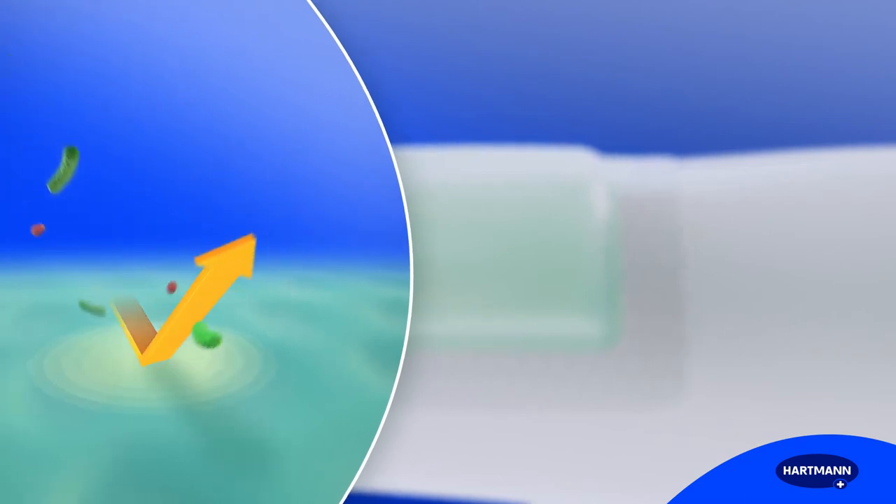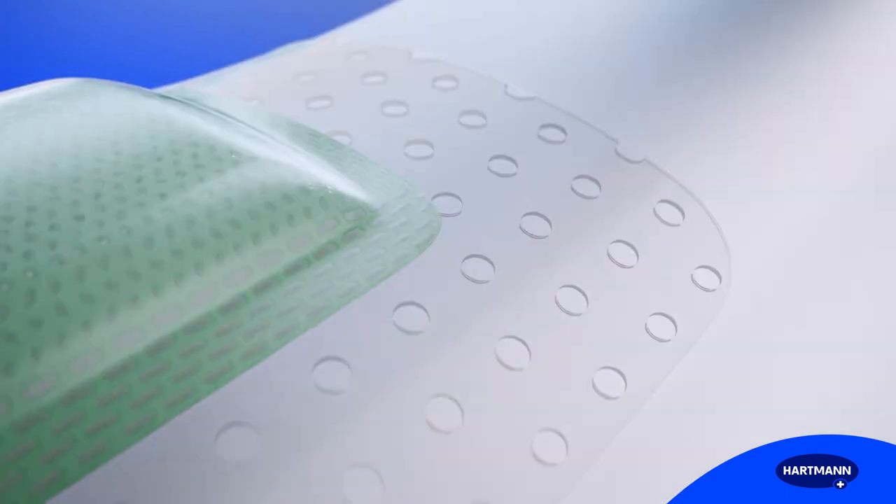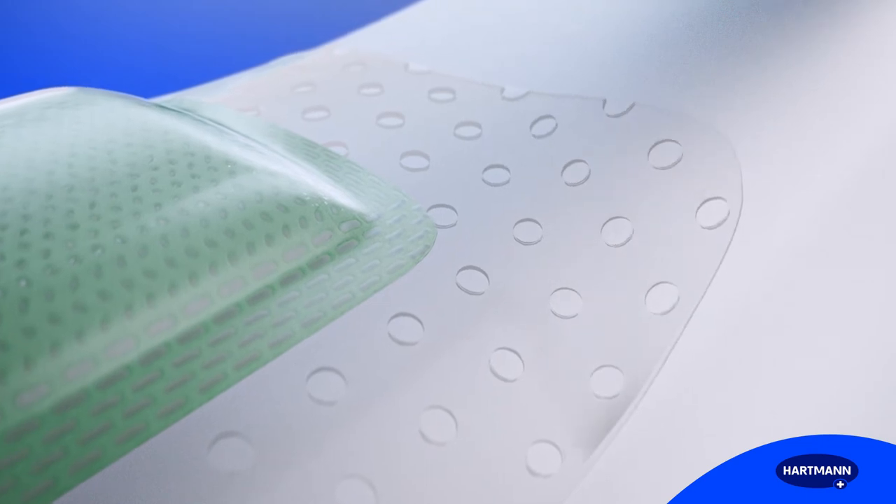The backing film is breathable and, at the same time, bacteria-proof, virus-proof and waterproof. The silicone contact layer allows atraumatic dressing changes, as well as repositioning of loosened edges.